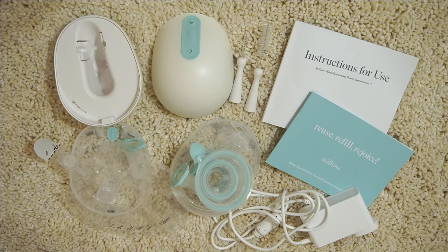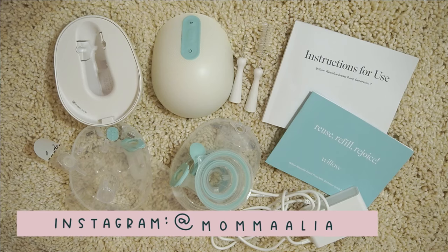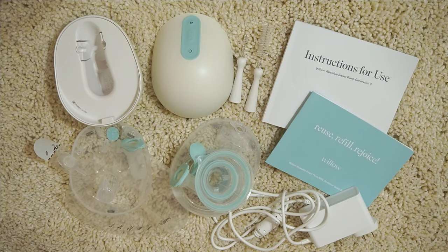Hey everybody, so today I wanted to share with you guys how to use your Willow 3rd generation breast pump. I've been using this pump for a couple of months now and have a pretty good hang of it. I thought I would walk you guys through what it comes with, how to put things together, even some stuff after you get done with a pumping session, just kind of walk you through it all. It is a pretty unique pump and there is a pretty good learning curve with it.